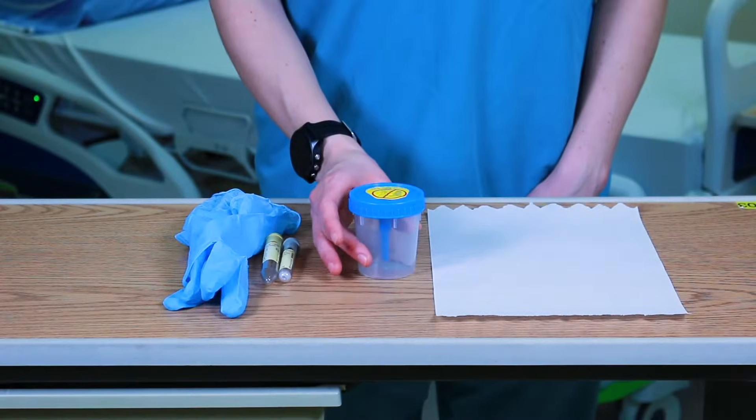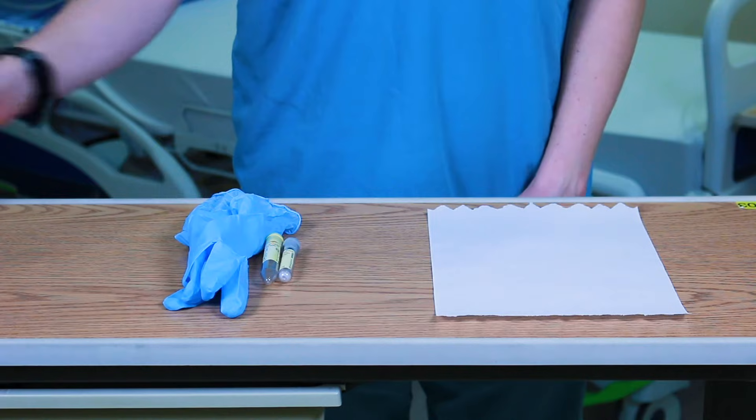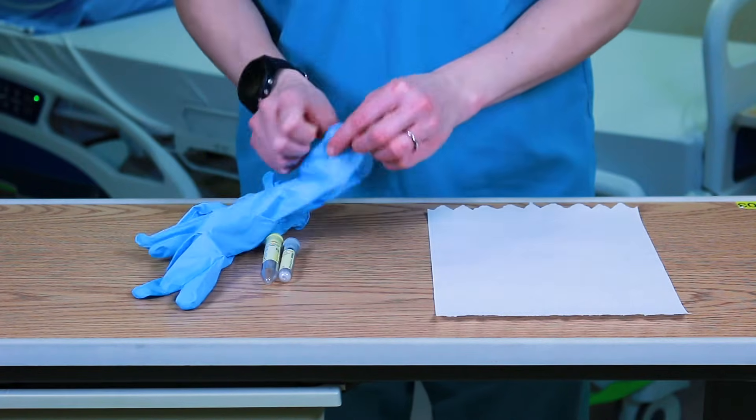Give the vacutainer to the patient and instruct on how to collect a clean, midstream urine sample.